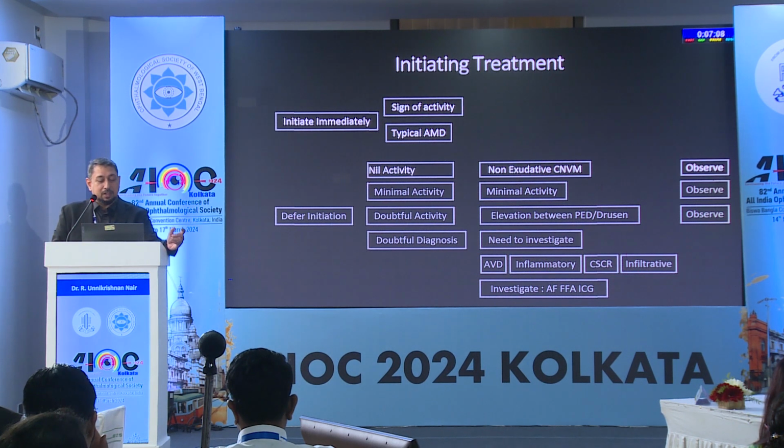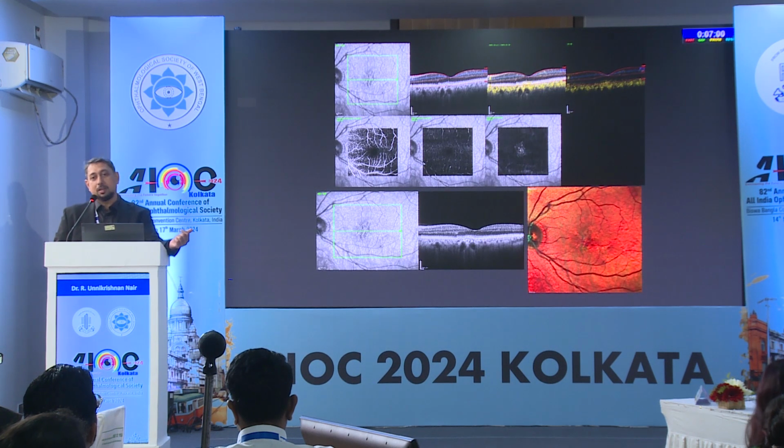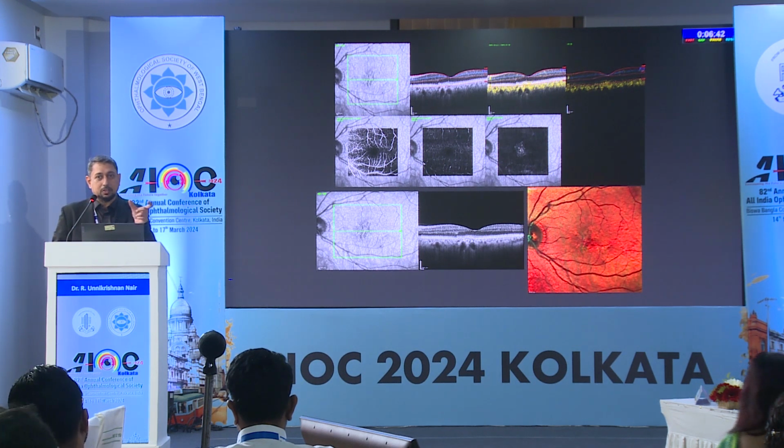But when would you defer? If you have nil activity. So what do you mean by that? You're putting it under AMD, but you're calling it nil activity. You're calling it a non-exudative CNVM. That is, it is an OCTA diagnosis. Looking at the picture, there is no CME, there is no hemorrhage, but on the OCTA, you see a subretinal network. So you have a non-exudative CNVM. It is not inactive, it is just not exuding. That is your first criterion where you would not treat. You would just observe the patient.